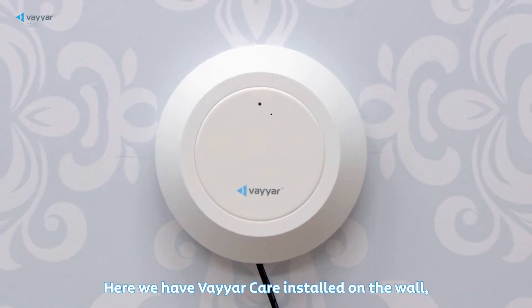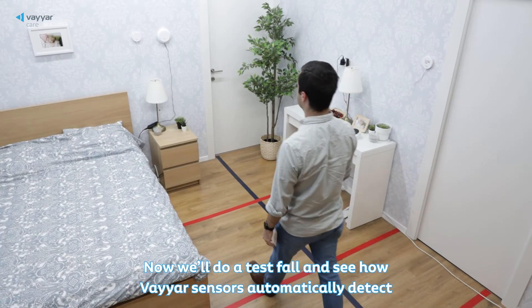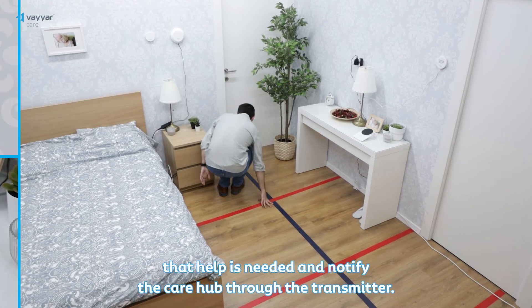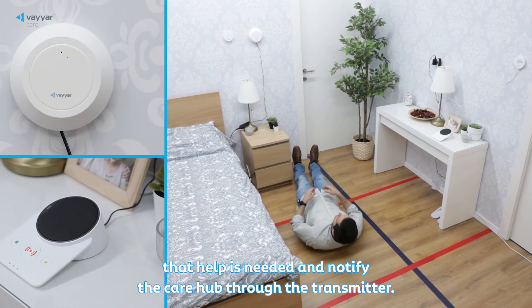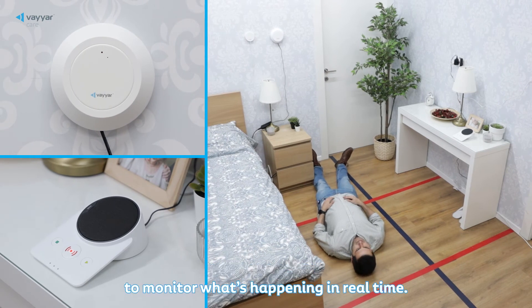Here we have Vayyar Care installed on the wall, already connected to the transmitter. Now we'll do a test fall and see how Vayyar sensors automatically detect that help is needed and notify the care hub through the transmitter. The device on the wall is continually scanning the room to monitor what's happening in real time.